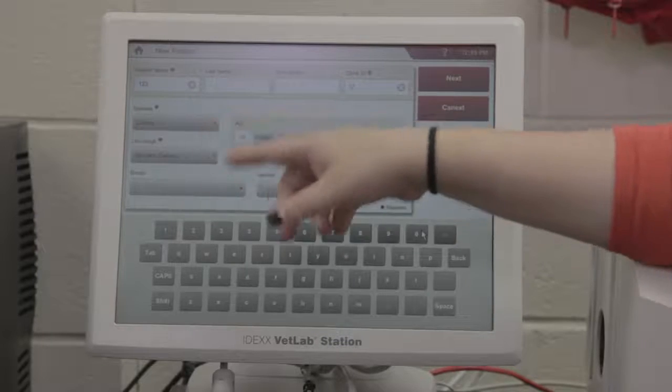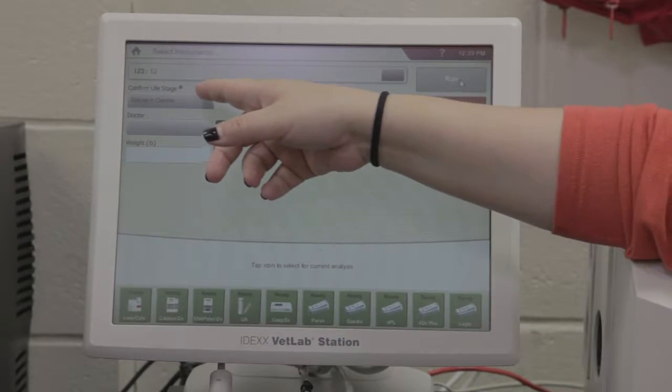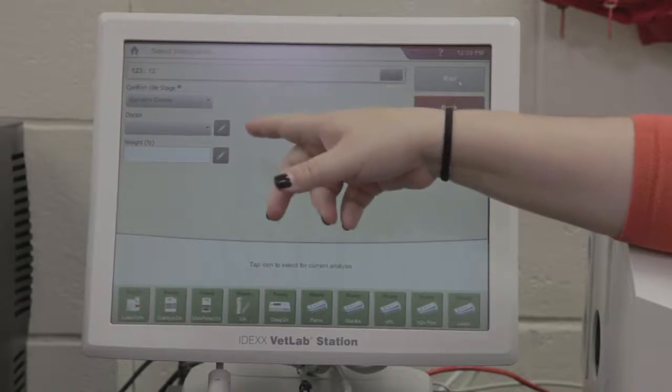Okay, so once everything with an asterisk is filled out, you're going to tap on next. I want you to confirm your life stage, and then you can enter your doctor information, and if you wish to, you can also enter your weight.